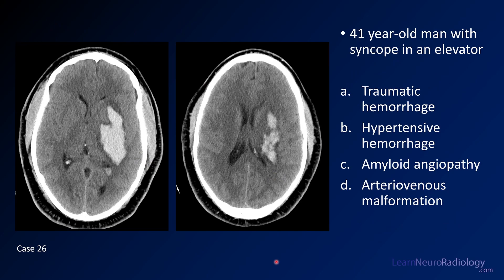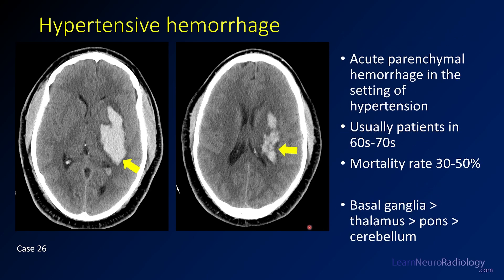Case number 26: a 41-year-old man with syncope in an elevator. Two CT images. Choices are traumatic hemorrhage, hypertensive hemorrhage, amyloid angiopathy, or arteriovenous malformation. This is a classic location for hypertensive hemorrhage — a lenticular form centered in the thalamus and basal ganglia. Even though this patient is slightly younger than typical, it's still most likely hypertensive. Common locations include basal ganglia, thalamus, pons, and cerebellar hemispheres. Amyloid angiopathy would cause more peripheral lobar hemorrhages. There's no evidence of an AV malformation nidus or abnormal flow voids here.